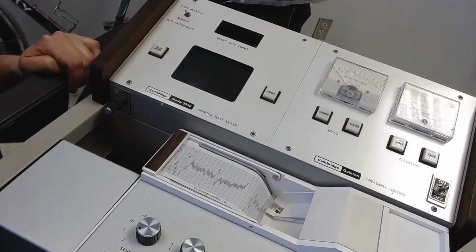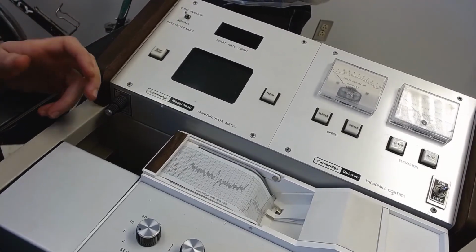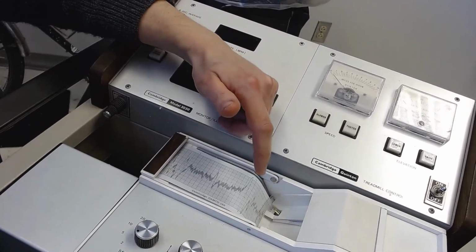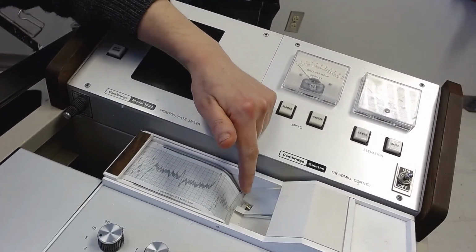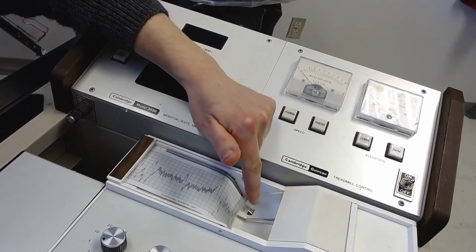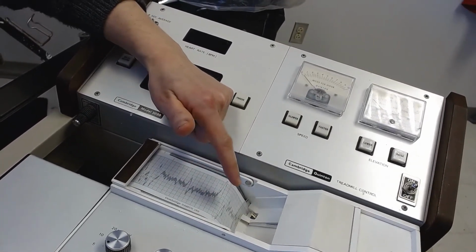So the same basic principles I was just talking about apply with this EKG, except in this case, the tiny electrical signals from your body actually get converted into a mechanical signal. And so there's a little pen in here, and so those signals get converted to the wiggling of this little pen that's set against this piece of moving paper that's right here. So anyway, with the Power Lab and the computer, we're basically accomplishing the same thing. We're just doing that in a digital format instead of in an analog format.